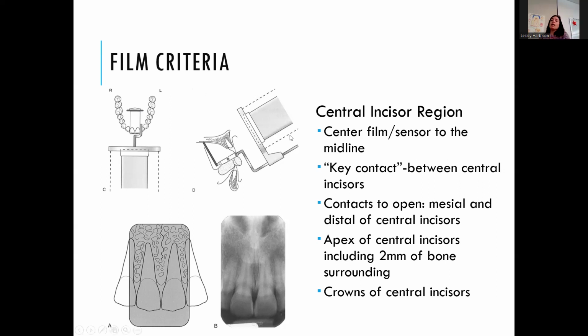Here it's showing the side, if you were to cut it in half and get a cross section. You see there's a fair amount of distance between the tooth and the film, whereas if this was a bisecting technique, the film would be coming off like this. So there's quite a bit of distance between these two, and you do end up getting a little bit bigger image. Then we have our central ray coming down through here, perfectly perpendicular. And this is showing a little bit of a cotton roll.